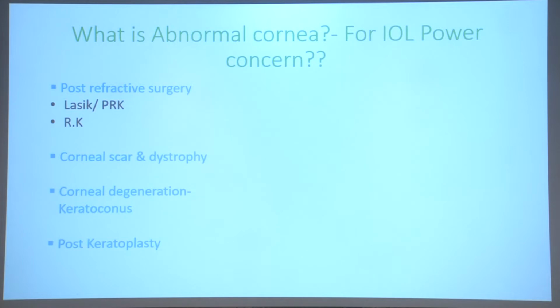So I'm going to talk about the post-refractive surgery corneas. These are abundant right now, and probably in 5 years' time, every third patient who comes to you for a cataract would already have a corneal refractive surgery done. And there we have LASIK and PRK and the RKs. Luckily, the RK patients are now dwindling, and fewer RK patients turn up for cataract. But against that, LASIK and PRK have exponentially increased. Corneal scar and dystrophy, these are the poor patients, and they are always going to struggle for good vision. So why not make them happy with fewer glasses or less irregular astigmatism?